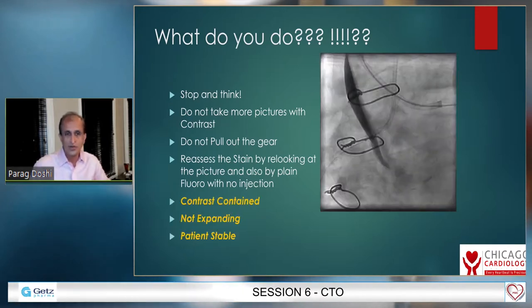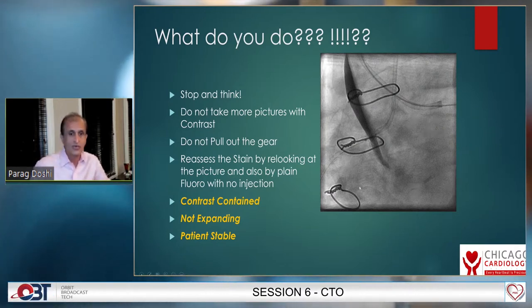So after doing this, I recognized that the contrast is contained. It's not extending anymore. So there is a dissection, but it's not going any further. It is not expanding, and the patient is totally stable. In fact, he was waking up and he was feeling fine. So what do we do?